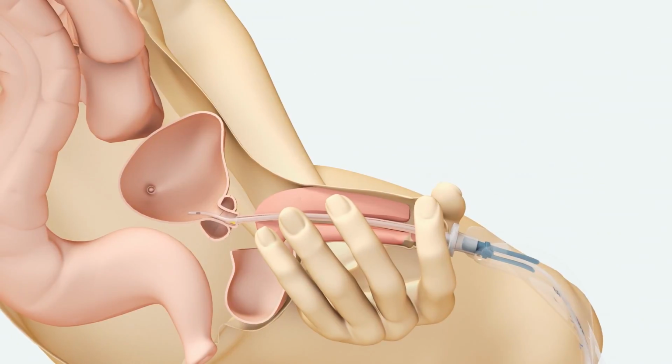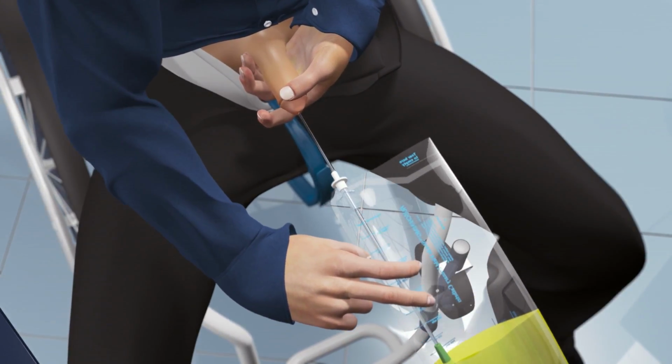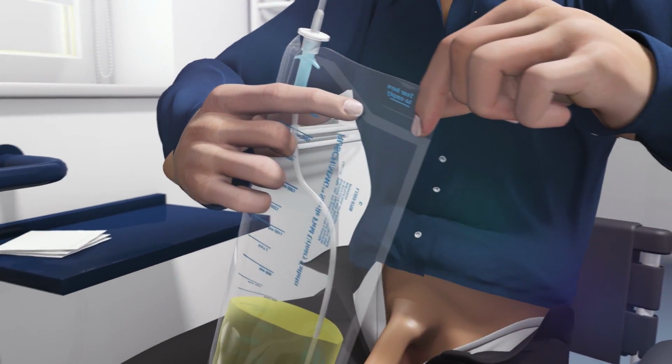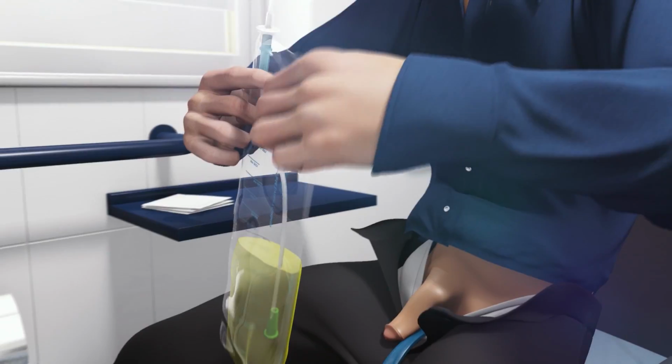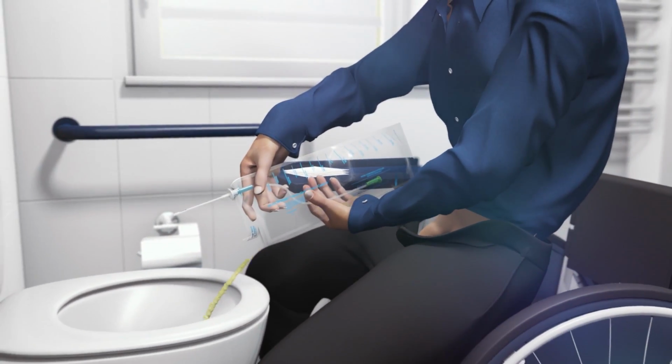After the urine stops flowing, gently remove the catheter with the bag attached. Grasp the bag at the corner where it says, "Tear here to empty," and tear the bag gently down towards the middle of the bag. This will allow you to dispose of the contents without any mess.